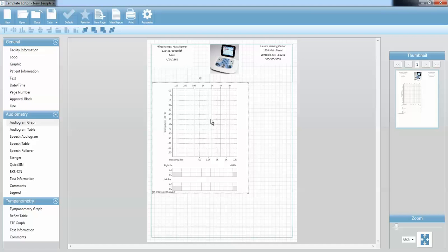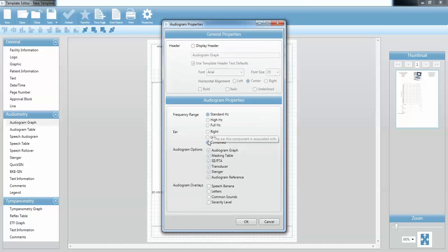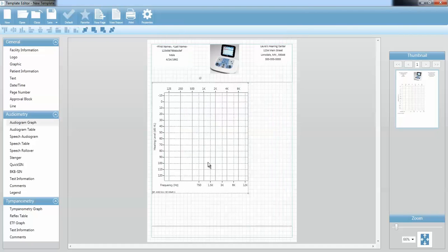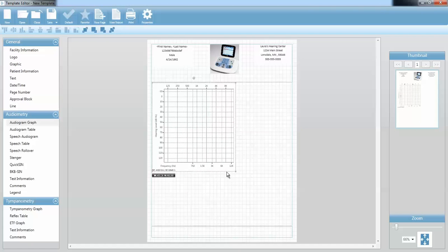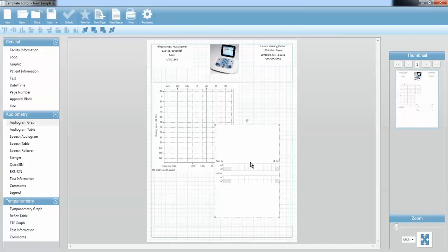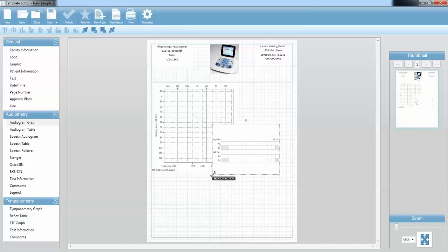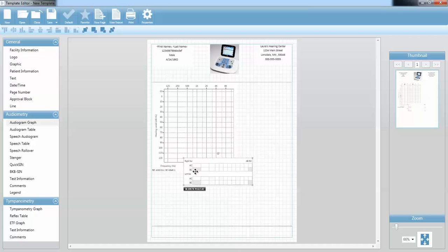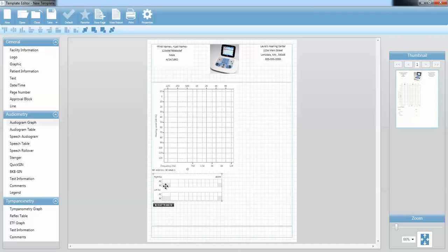I can choose which components I want included in this graphic by double-clicking or right-clicking and selecting Properties. For this audiogram, I am going to use the combined audiogram. I want my audiogram graph, but I don't want my masking table at the bottom, so I'm going to uncheck that one. I'm going to uncheck Stenger and press OK. So now I have just a plain audiogram graph. I do need to include my masking table at some point, so I'm going to make the audiogram a little bit smaller and drag over another audiogram graph component, click on the properties, uncheck the graph and all the other information, and now I just have that masking table. I can resize it and reposition it by clicking and dragging.